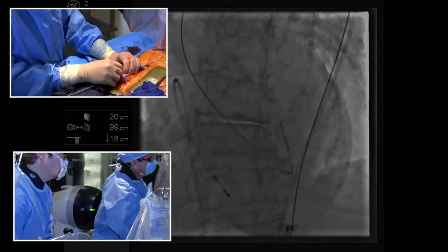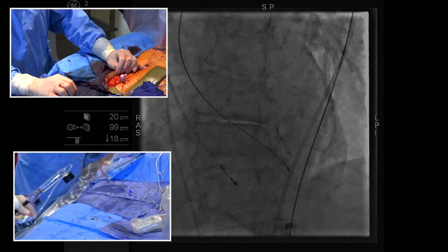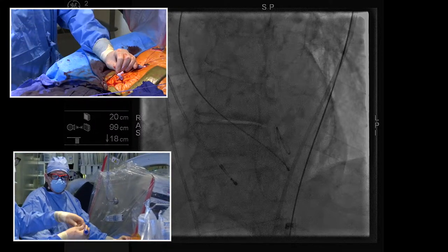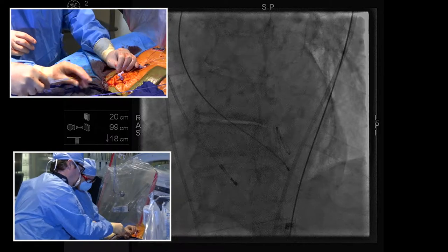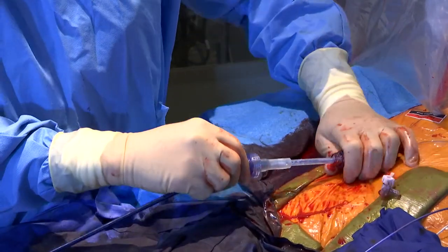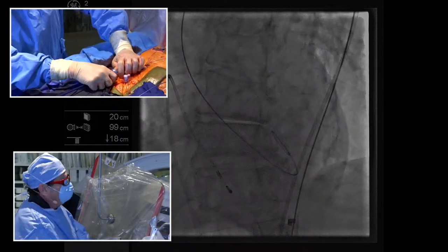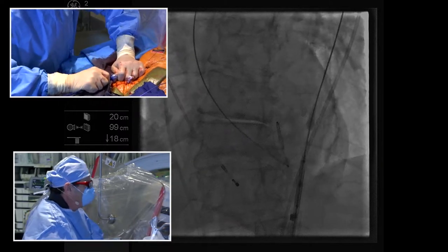So let's get the valve. The valve has a loader. The first thing the valve assembly system has to do is go through the valve of the sheath, right? So we don't want it to get ripped and destroyed, so there's a nice plastic sheath over it. So Edwards is up, right? And I'll put this through the sheath, done. And then I'm gonna pass the valve through, and I can tell the access is pretty good here. I'm stretching the sheath with the valve as it passes through, and I have to push pretty hard, but I don't have to push that hard. That means the artery is pretty big.